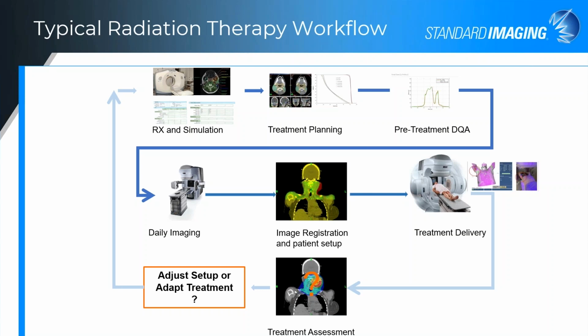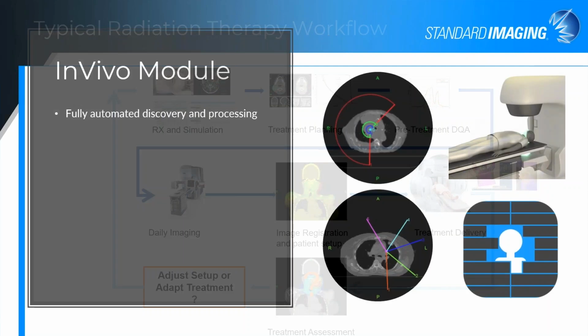Hopefully, we help answer that question of whether or not the patient needs maybe some type of setup adjustment, or worst case scenario, maybe the treatment needs to be changed. So that's sort of the goal here.